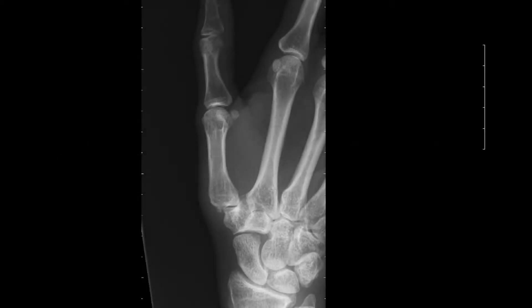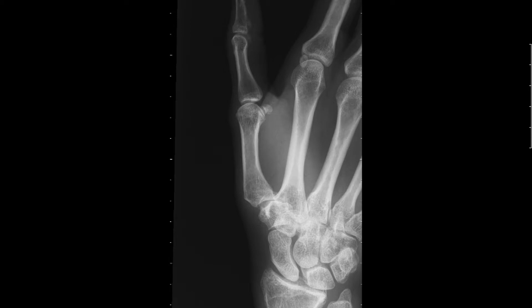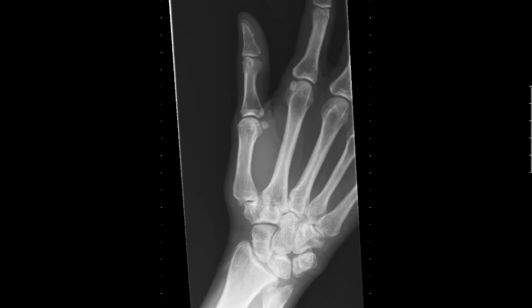This is a 51-year-old right-hand dominant female who has failed conservative management for her basal joint arthritis, including steroid injections, PRP injections, and occupational hand therapy. X-rays demonstrate moderate-stage CMC joint arthritis of the thumb with a possible loose body.